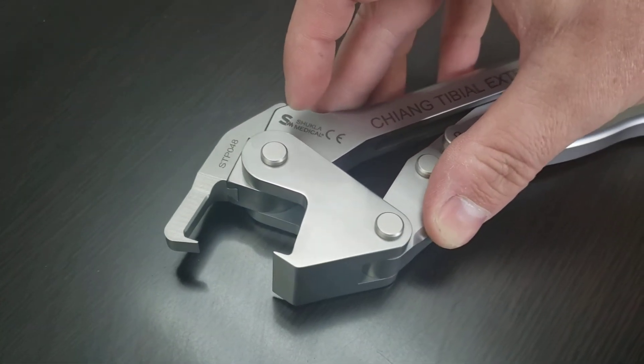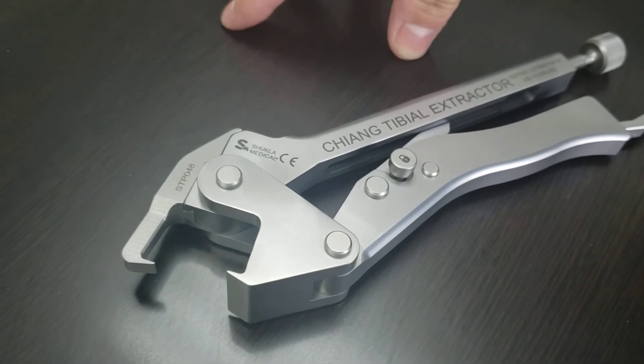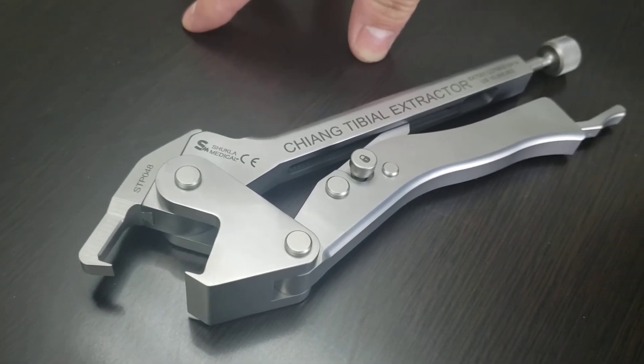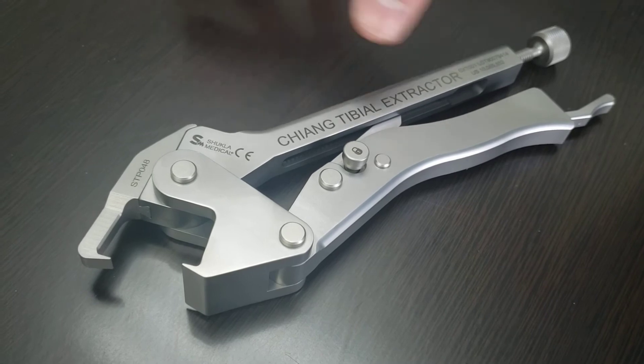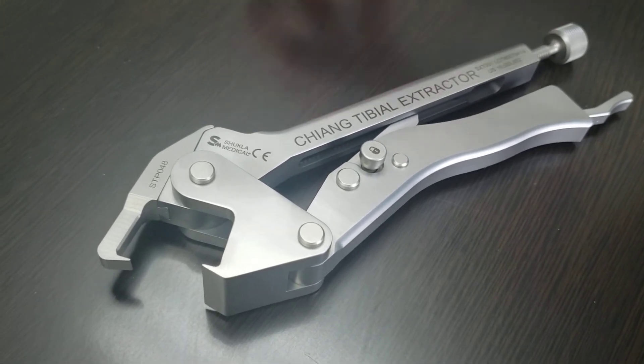Unfortunately, for the first production lot, the mating parts were not made to the specifications of the drawing. So if the modular jaw breaks and needs to be replaced, there's a possibility that the replacement jaw will not mate properly with the extractor since they're not made to spec.